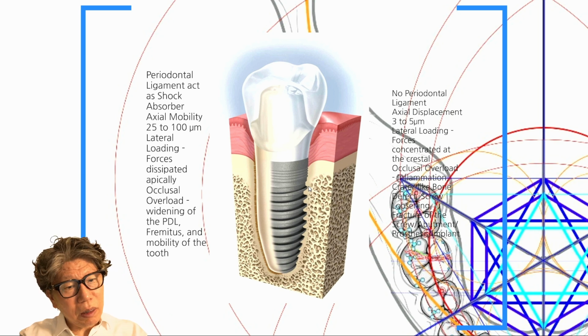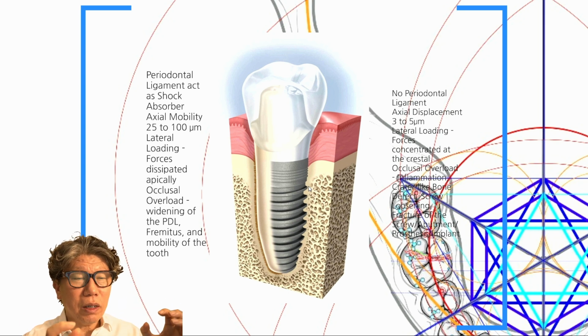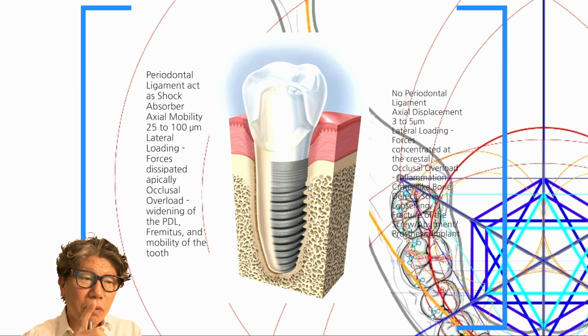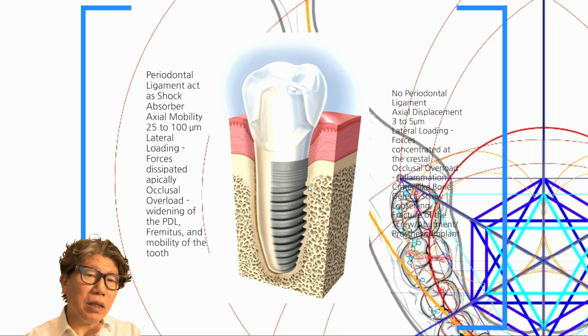So intimate contact is like this. If there is moisture between two sheets of glass, they cannot be separated. You cannot separate these two sheets of glass. So I think of it as the principle of surface tension. Therefore, it seems that the principle of surface tension is at work, allowing the implant to be continuously maintained within the bone tissue.